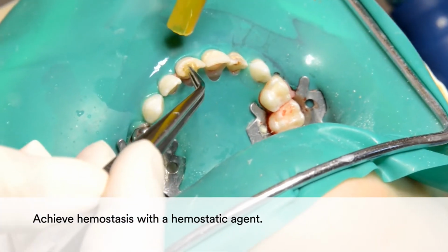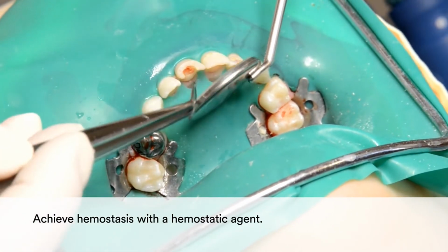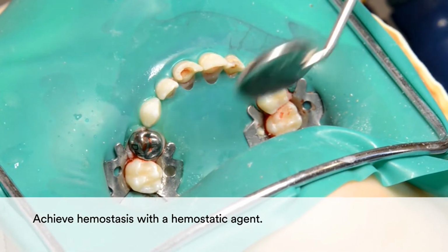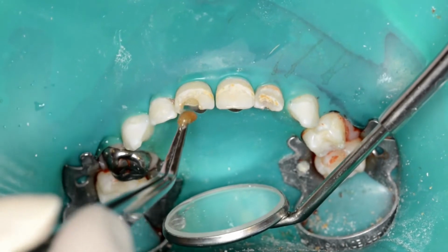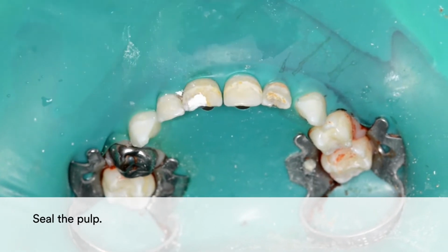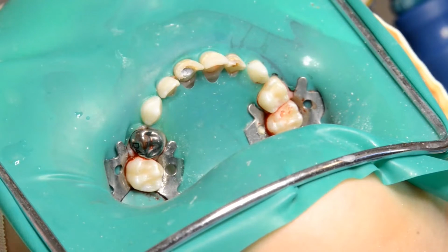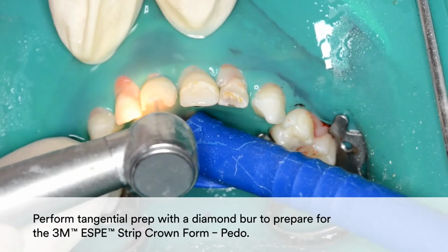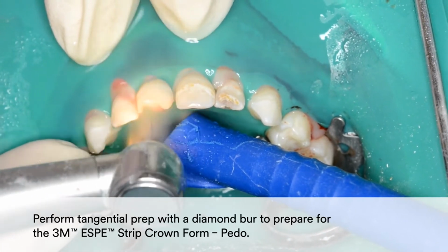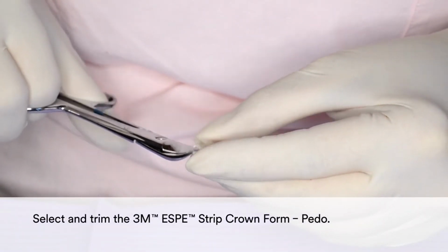If bleeding occurs, use a hemostatic agent to control it. Then seal the pulp. Then perform tangential prep with a diamond bur to prepare for the 3M strip crown form. Select and trim the 3M strip crown form.